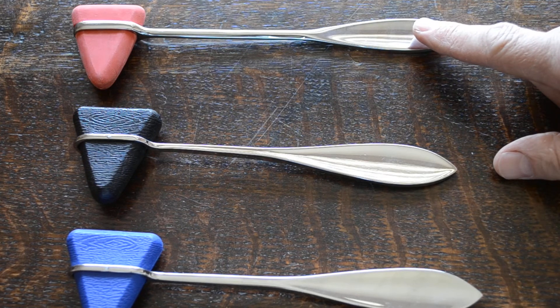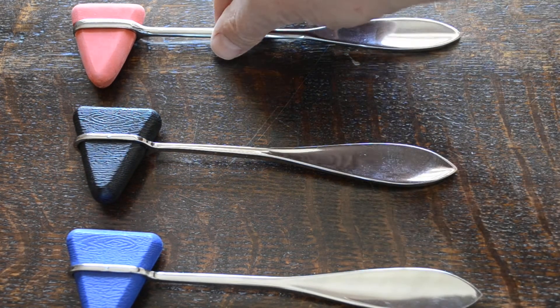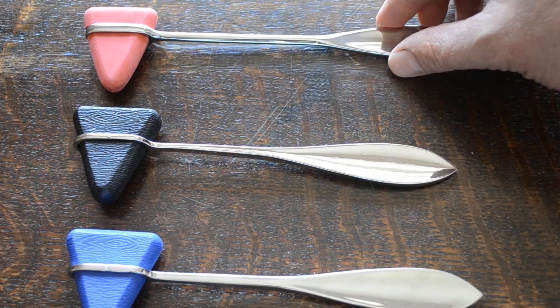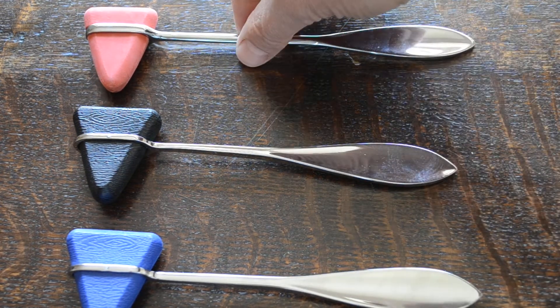The top one is the rubber-headed steel-handled Taylor's reflex hammer. This is a 20 centimeter overall length on the handle.